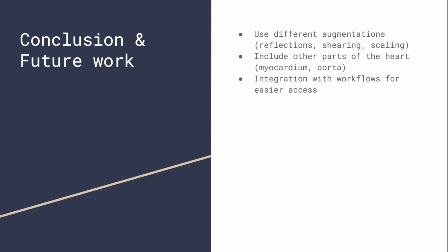All right, so conclusion and future work. We could use different augmentation, like I said, because the movement is pretty complicated: rotation across different axes, combined with translation and shearing. And then we could include other parts of the heart and integrate with workflows for easier access.